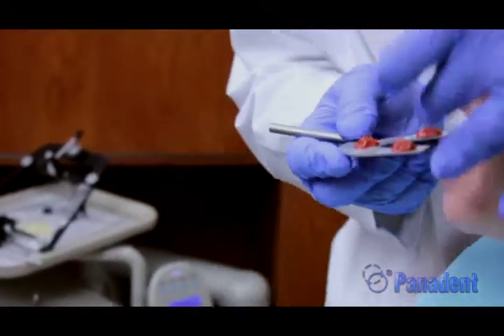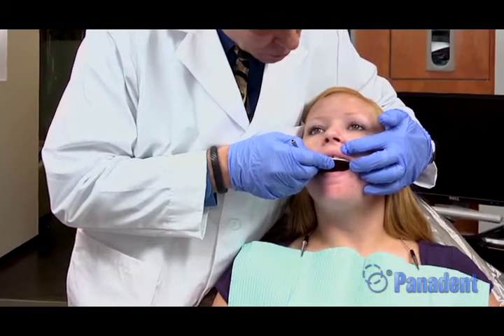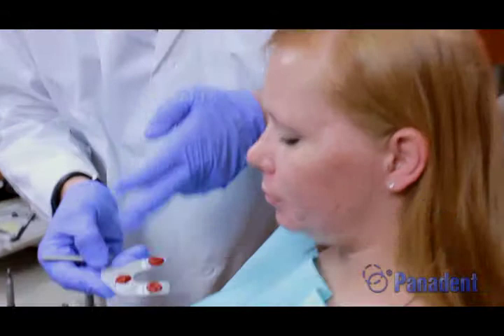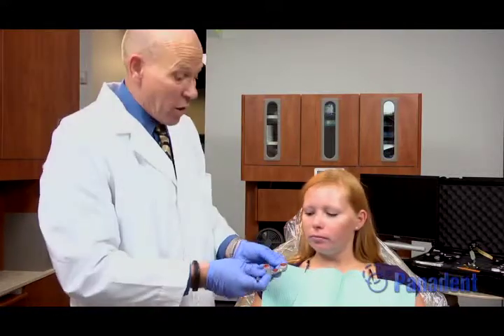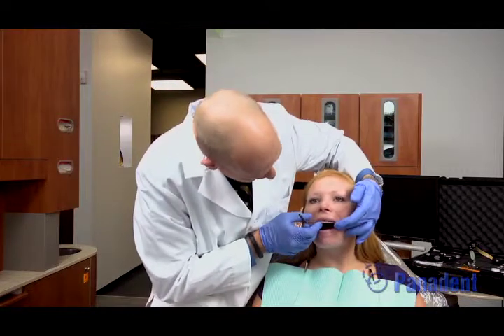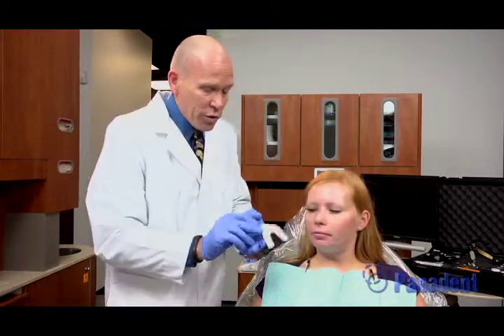Now we can come to the patient, rotate, and get the dental midline mark aligned to the dental midline, and we can push up slowly getting indentations of the teeth into the compound. I'll go ahead and chill this compound to harden it. I've now hardened the compound. We'll try it back in the mouth to make sure it fits accurately and doesn't rock around. It looks really, really nice, so we're going to go ahead and use that.